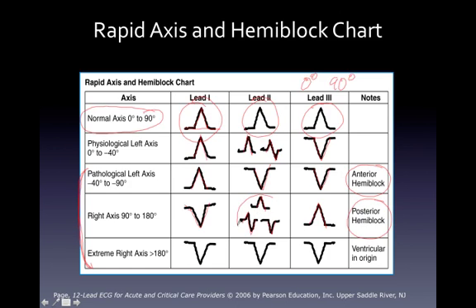As far as this lead goes, this is probably the most confusing and the hardest one to catch on a right axis deviation. If you are at 90 to 180 degrees, it would depend on how severe your right axis deviation is.